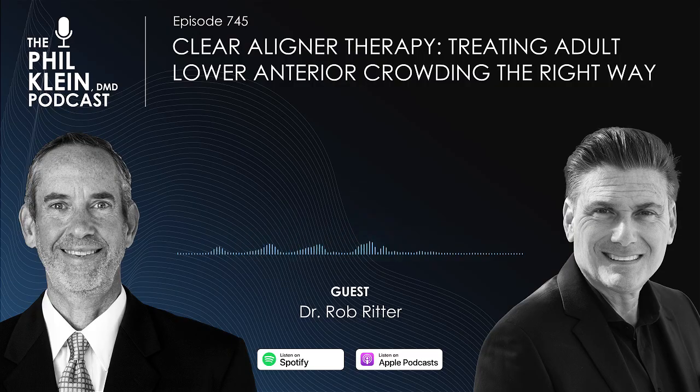Now, of course, we have chairside scanners, and every patient gets scanned, whether they're a new patient in hygiene or they come in for a consultation. And by manipulating that image, they're seeing that the teeth are crowded, and the patient always asks, "Are those my teeth?" Of course, yeah. Who else's are they? They're yours. "I didn't know my teeth looked like that." They do. I said, and I asked the simple question, "Are you interested in straightening your teeth?" And they go, "Well, I don't really care what they look like."